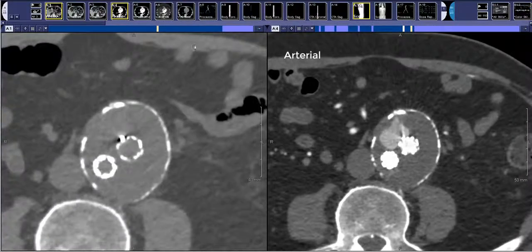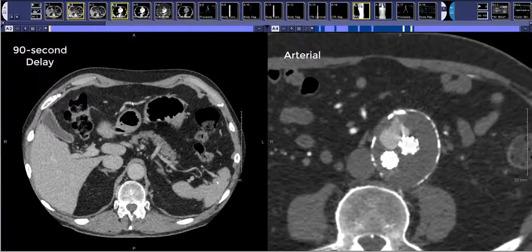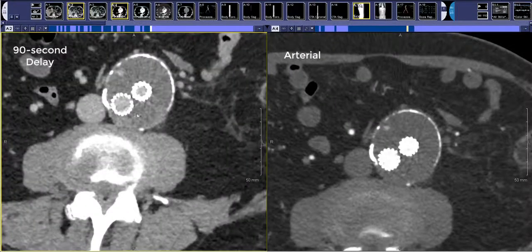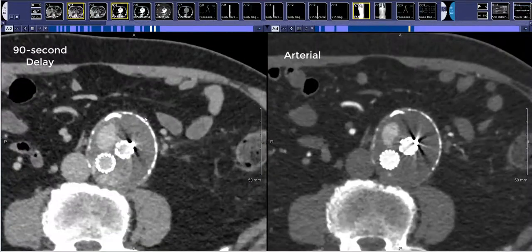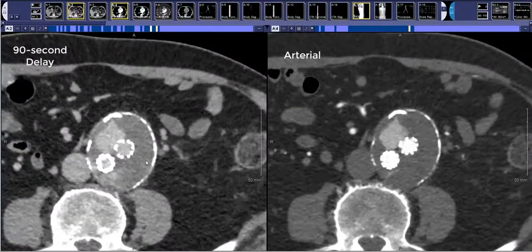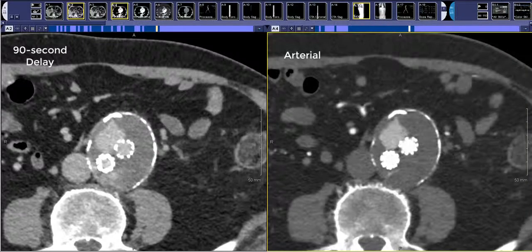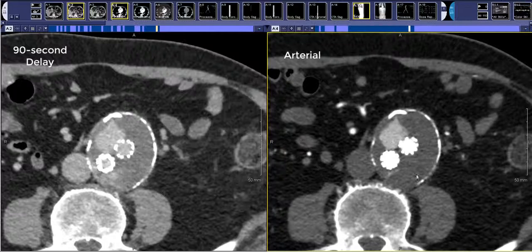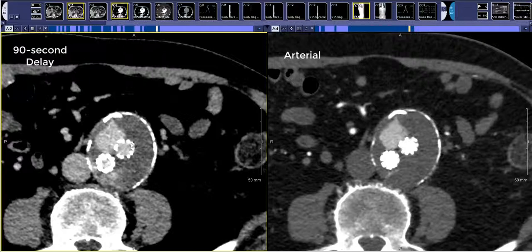The last part of the endograft CTA is a 90-second delay. I'm putting that on the left-hand side of the screen. We get this to look for more subtle endoleaks as well as to confirm endoleaks. If there is an actual endoleak it should follow the luminal attenuation of the aorta. You can see on the arterial phase on the right it's brighter than on the more delayed phase on the left.